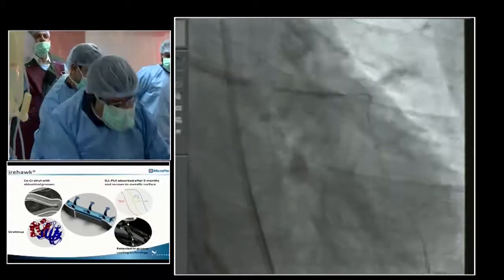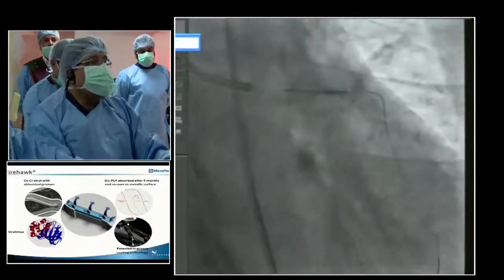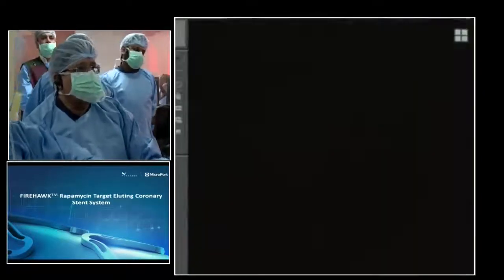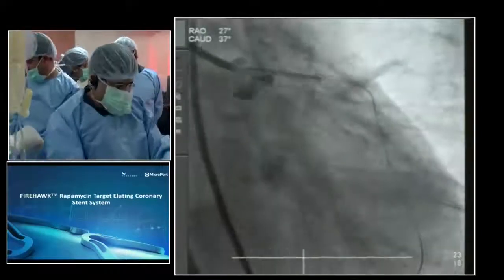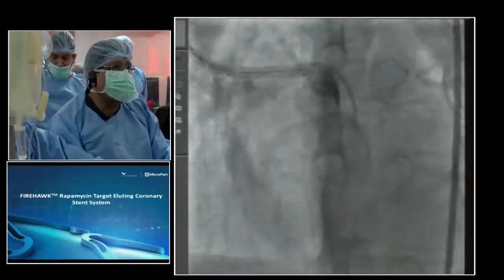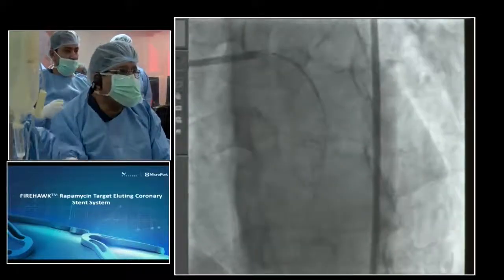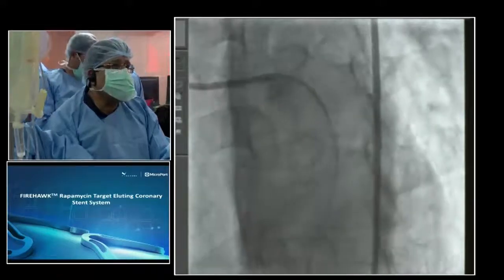And now I have to, just a moment. Now, which view would the house like to have the ostium of the left main nailed? Small test. Test again. Okay. Test. Go to LAO cranial, please. Oh, give me that wire again. Yes, sir. The wire again. Small test. Less LAO cranial, please. Small test. Small test. Looks okay. Keep it back. Small test again. I think it is okay as far as the left main is correct. Very small test, please. Yeah. Okay, go ahead. Deploy the stent.